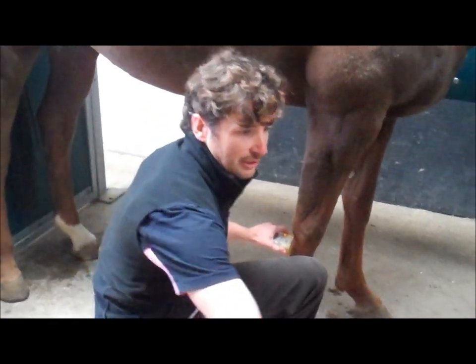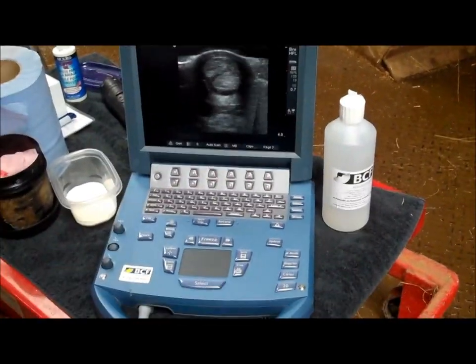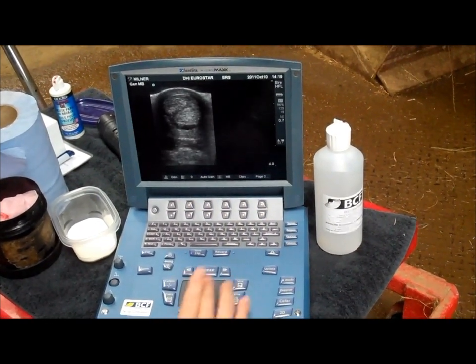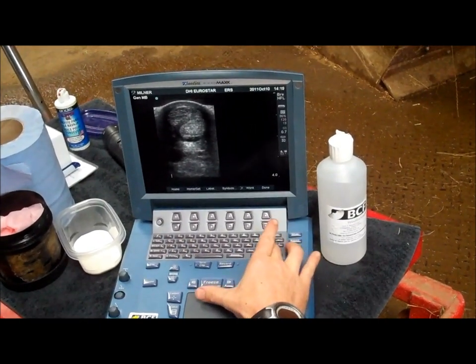This is a scanner that you can very much put the probe on and go. We have a lovely image acquired already. There's a nice user-friendly menu with some quick keys, so we can go to page two and do a dual screen split, so that I can freeze this image. With a text button we can record details of the leg.